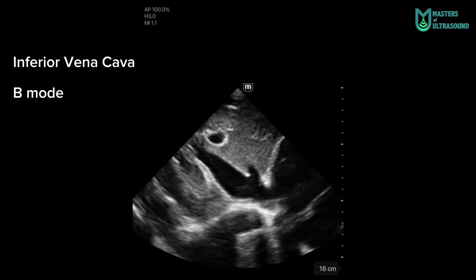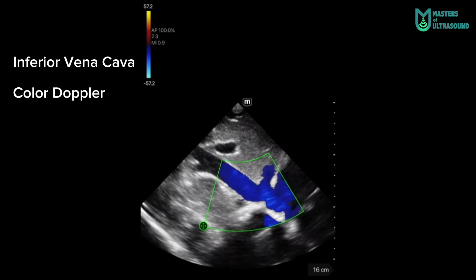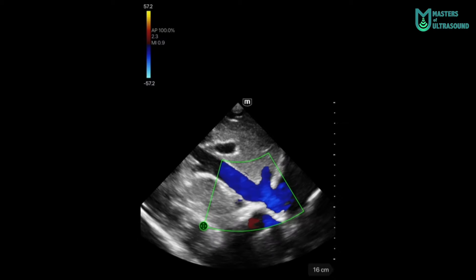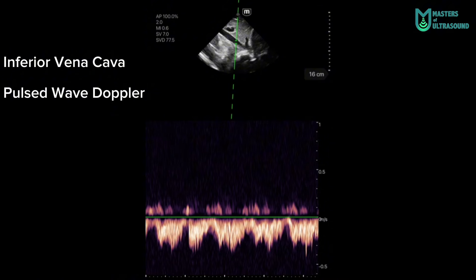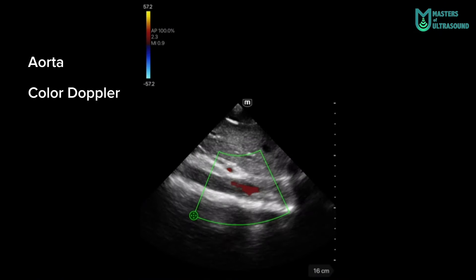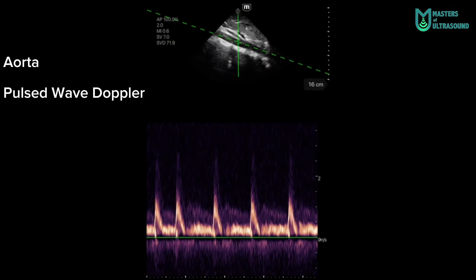Here you can see the inferior vena cava draining blood to the right atrium, and here with the color doppler — the suprahepatic vein as well. Here you can see a pulse-wave doppler at the inferior vena cava. I forgot to include the pulse-wave doppler at the portal vein and suprahepatic veins so you could see the VExUS exam. Here is a pulse-wave doppler at the abdominal aorta.